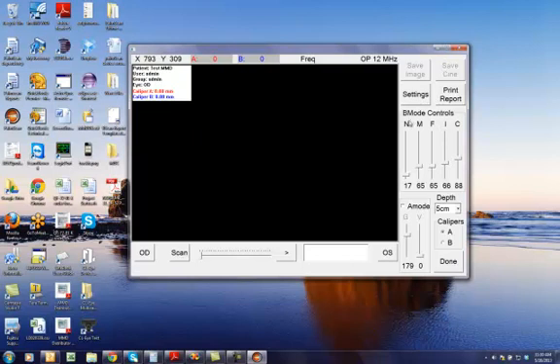These are the B-Mode controls, which are the gains for the near, mid, far. These are the near, mid, far gains.